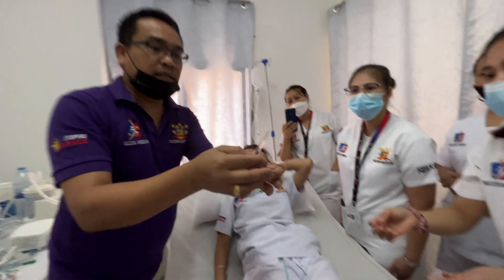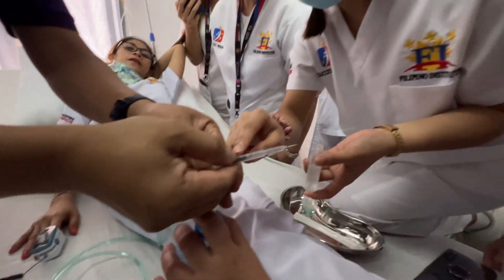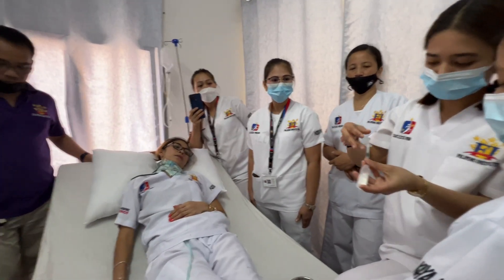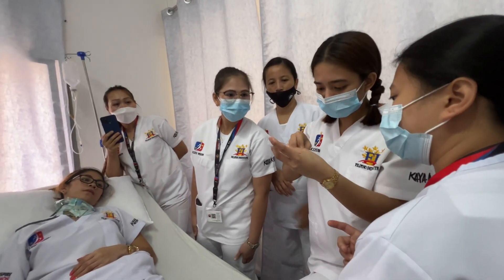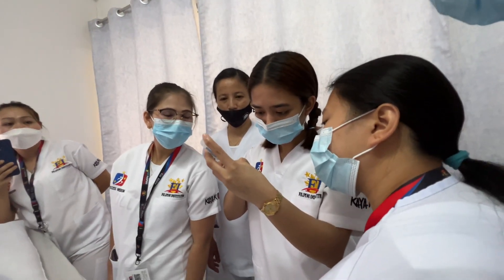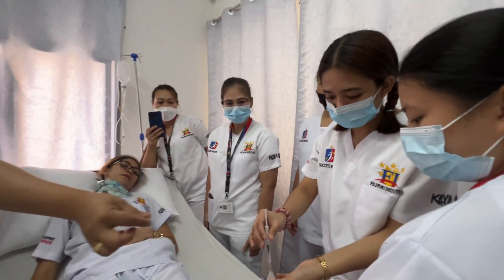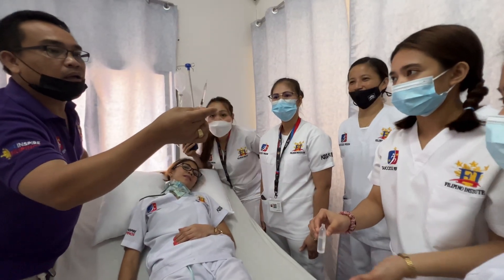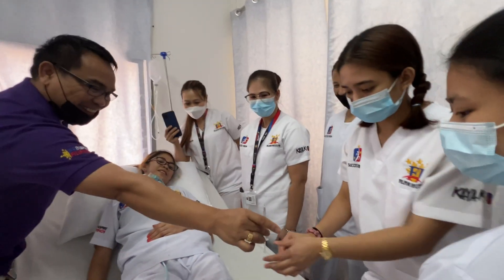This is the 0.4 mark — that's the first black line, the first plunger line. That is 0.5. Always cover the needle after drawing up your medication.